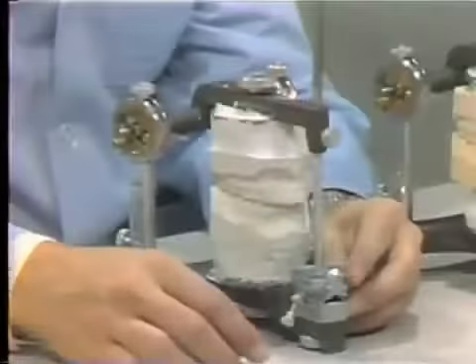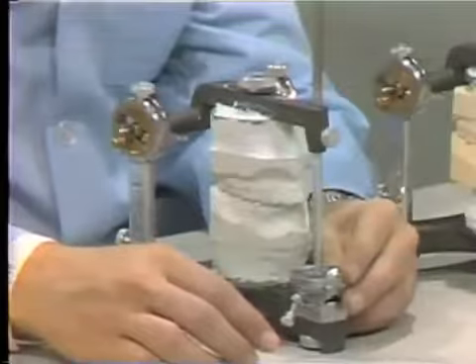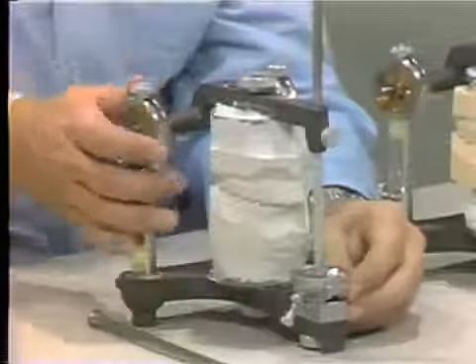Remember, the purpose of the incisal guide table is to simulate or duplicate some of the guidances provided by the teeth in the protrusive or the lateral excursions without causing wear on the teeth, and thus decreasing the vertical dimension. First, we would have the case in which the incisal guide table could accept the relationship in the protrusive excursion.